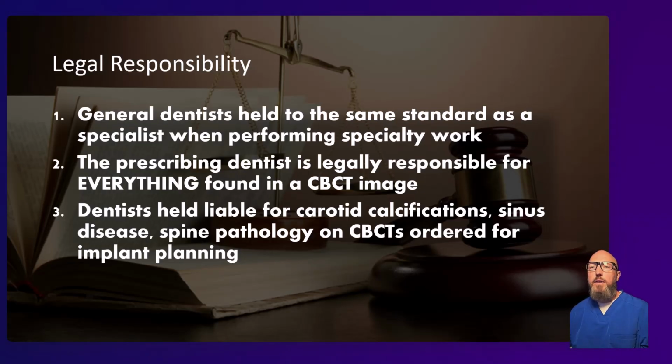All right, this part of the video is really important. I want you to remember this: legal responsibility for CBCT interpretation. When you order or take a CBCT, you're the one legally responsible for everything in the volume, not just the area you ordered the scan to evaluate, but everything, the entire data set. That applies to general dentists the same way it does to me as a radiologist. And so why does it matter?